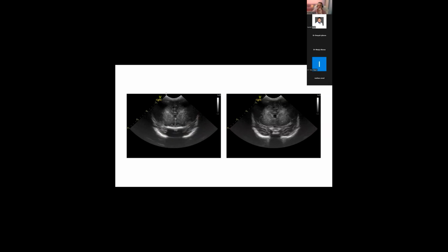Now let's just critique this image. When we look at this particular image, is it good? Is it bad? Is it okay? Feel free. Okay. Thank you, Deepak. Great. You're absolutely right. It's okay. The smallness of the fontanelle means that I've got a lot of dropout coming in the lateral fields. When I talk about dropout at this particular point, I'm just going to annotate over here.